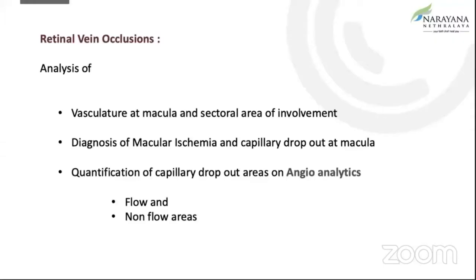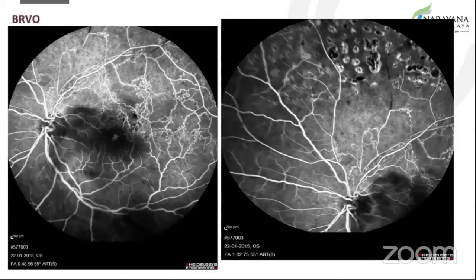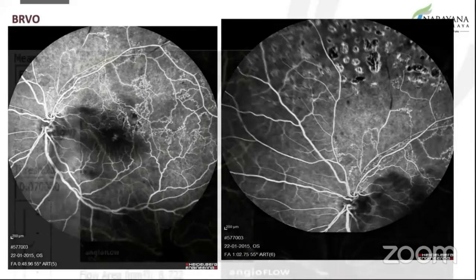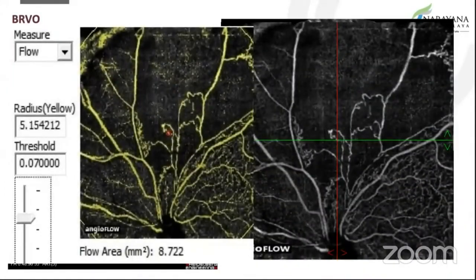Going over to retinal vein occlusions, OCTA helps us in assessing the vasculature, the macula, and also delineating the sectoral involvement. Diagnosis of macular ischemia is quite easy, which is very common in these patients, and capillary dropout as well. We can quantify using the analytical tool into flow and non-flow areas. This is a patient where you can see the area of non-perfusion on the dye-based angiography, and subsequently laser was done. Comparing with the OCTA, you can see how well the non-perfusion area is delineated in a non-invasive fashion.